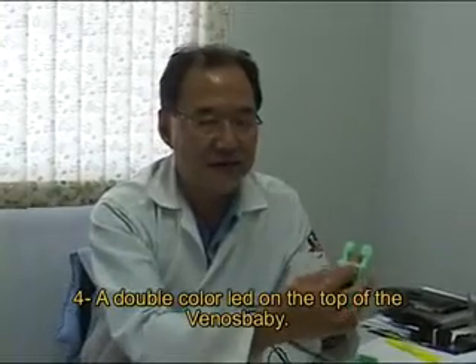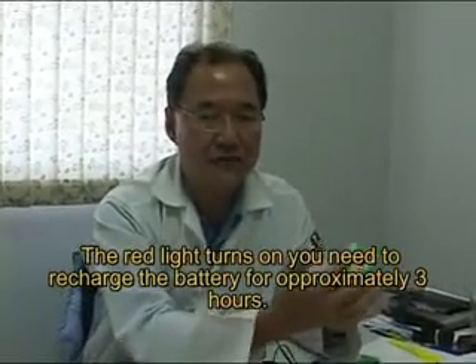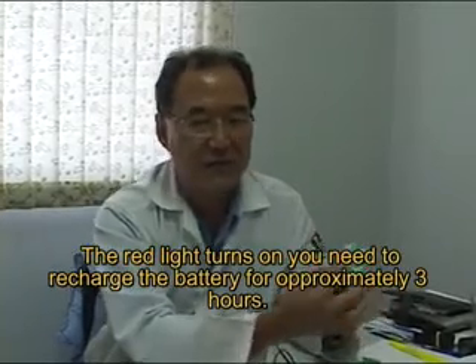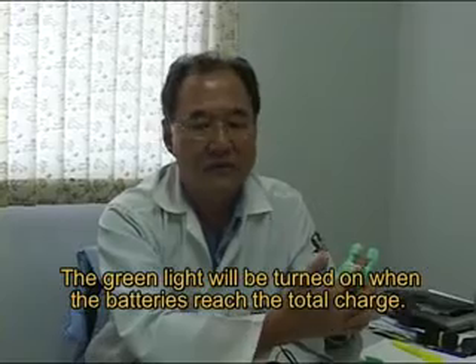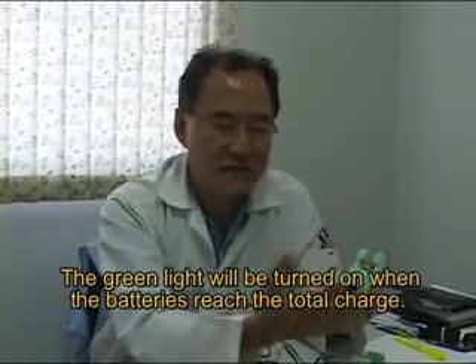When the red light turns on, you will need to recharge the battery for approximately three hours. The green light will turn on when the battery reaches a full charge. As you can see, the VENOS BABY is very easy to use.